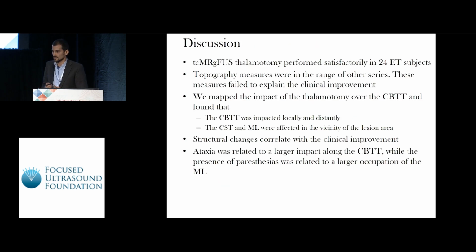Therefore, the conclusions are that we performed overall satisfactory VIM HIFU in 24 essential tremor patients. The topography of the lesions is similar to that which has been reported so far. We did not find any correlation of the topography to the clinical effect, which was surprising.